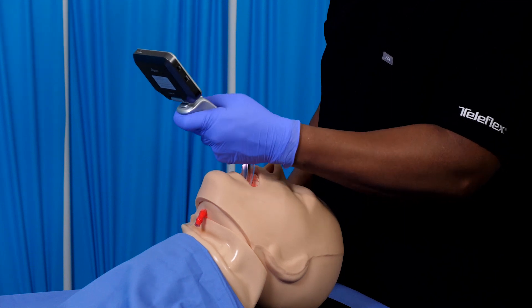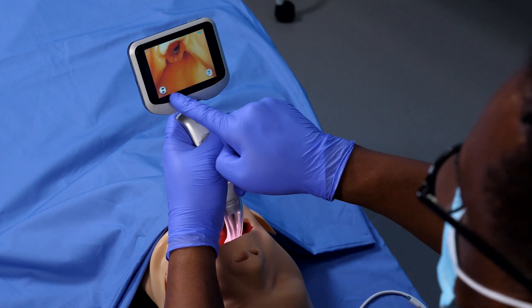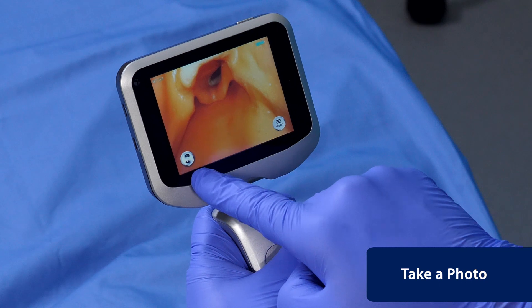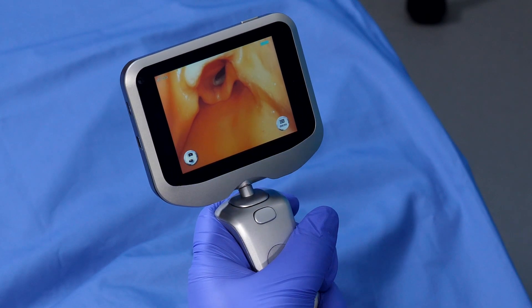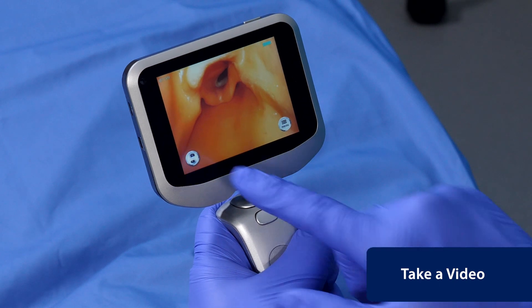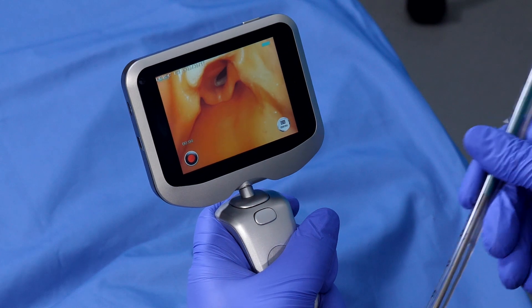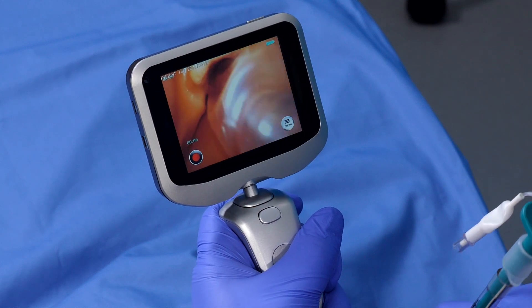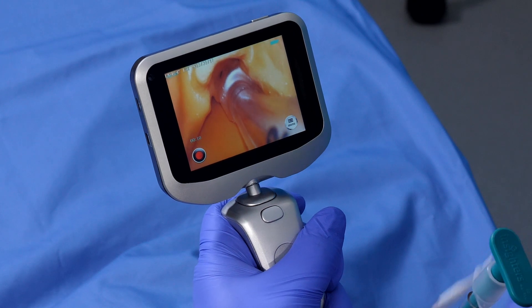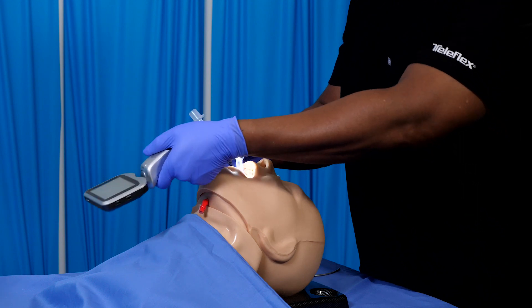The video laryngoscope supports photo and video capture and saves this data to its internal memory. To take a photo, quickly press the photo/video button on the screen. To take a video, hold the photo/video button on the screen for 2-3 seconds. You will hear a confirmatory sound and the recording time will begin. Hold the button to stop recording and remove the video laryngoscope.